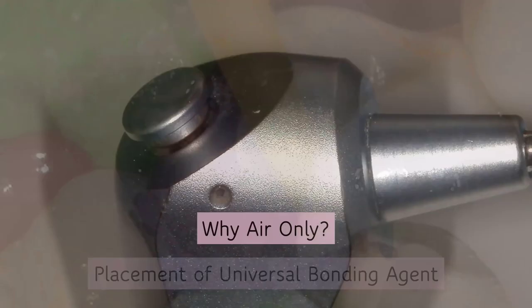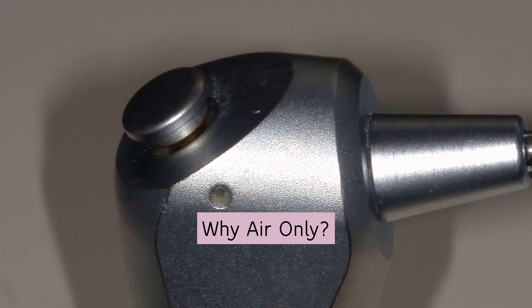With a universal bonding agent, you're going to scrub it in for about 20 seconds. Here's the key step: if you use an air-water syringe, you are bringing water back into that preparation — instant micro-leakage. Use an air-only syringe, going from a distance, then come closer with more pressure. Airing to me is 10 seconds — there is no such thing as a two-second air dry. That's the number one reason for post-op sensitivity. You want to lightly air dry from a distance, then come closer and complete air drying for another five seconds.